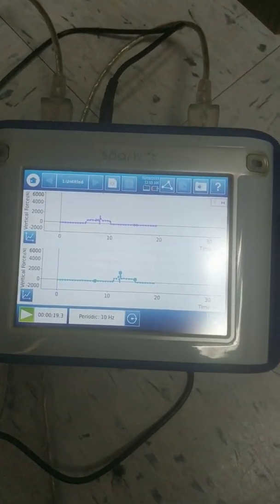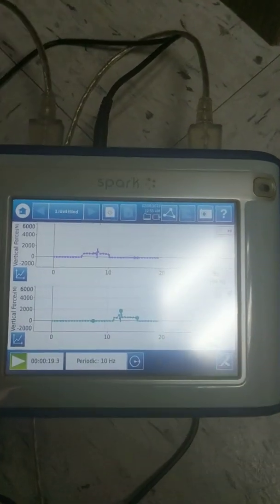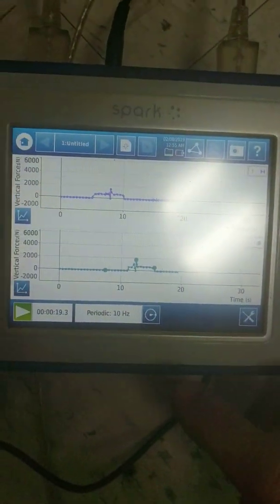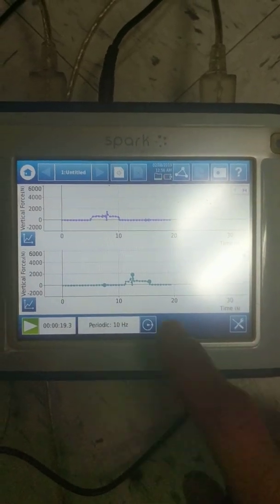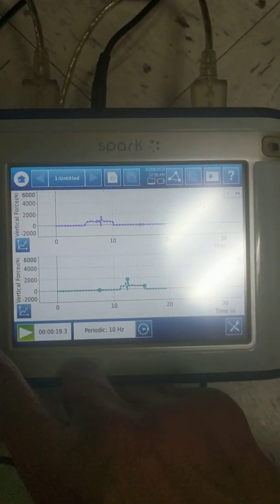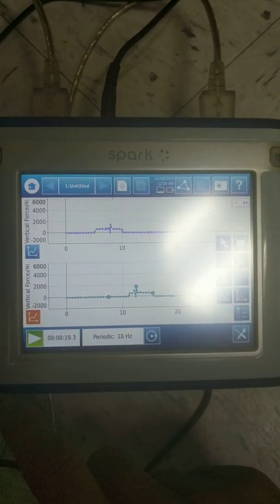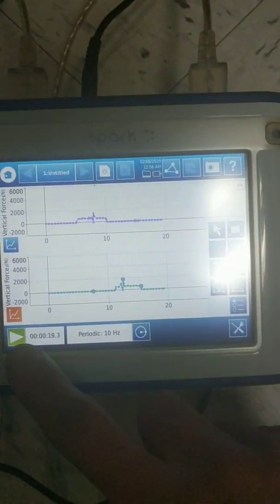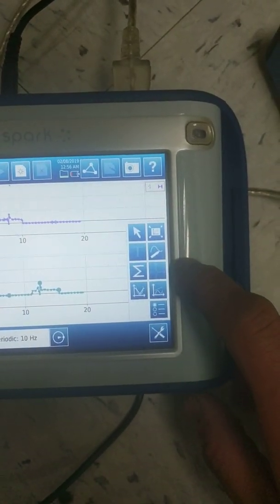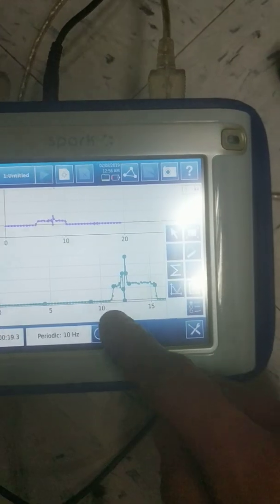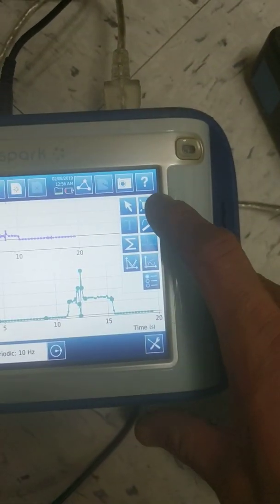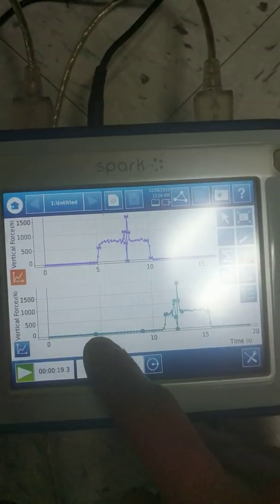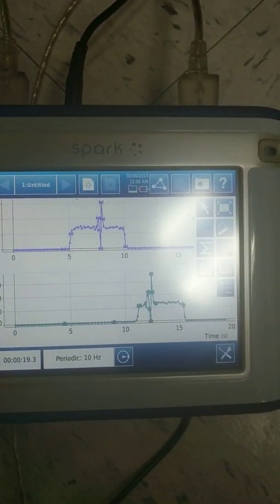You can take a snapshot of this, but before you take a snapshot of the screen here, it's good to autoscale. And that's done with this button here. You press that button for the tools and one of the tools is the autoscale tool. There it is, the autoscale tool. So I'll press this button for tools and then I'll press this button for autoscale, and that just makes it a little bit more visible.